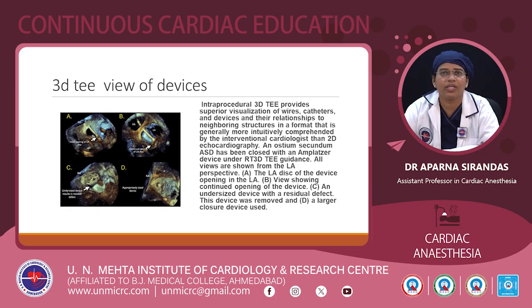In this, an ostium secundum ASD has been closed with an Amplatzer device under real-time 3D TE guidance. All views are shown from the LA perspective. So in this A figure you can see LA disc of the device opening into the LA, and B is the view showing continued opening of the device. C is undersized device with a residual defect. This device was removed and a larger closure device was used.